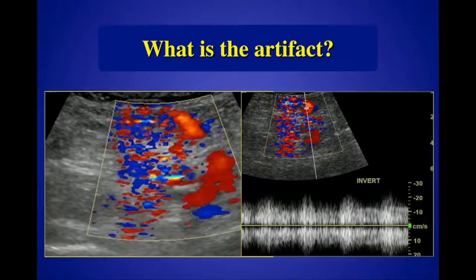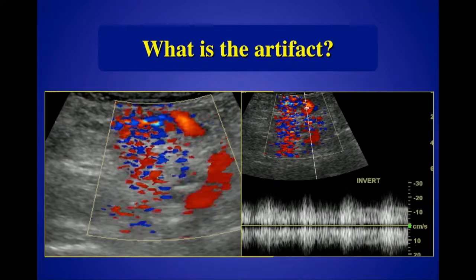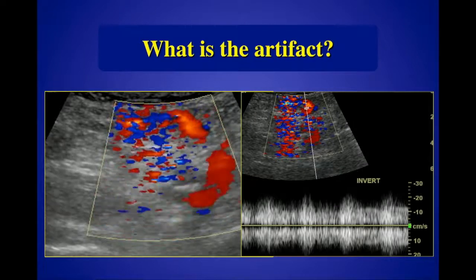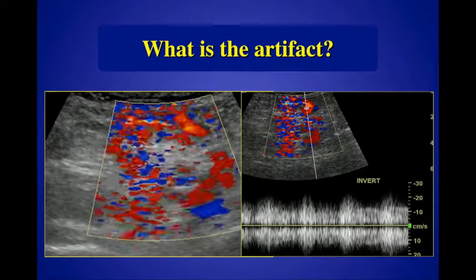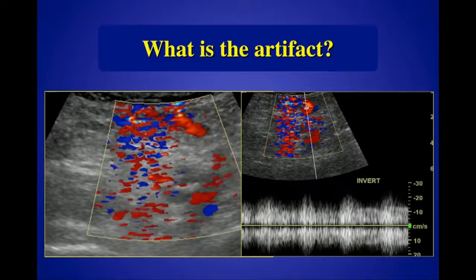And of course, that's the key to doing these studies. Look for the puncture, and you put the probe on top of it. You don't have to go fishing around looking for the abnormality. You go to the puncture site. And at the puncture site, you see all this color rain. And so I sample around that, and you can see I get this sort of arterialized flow pattern.